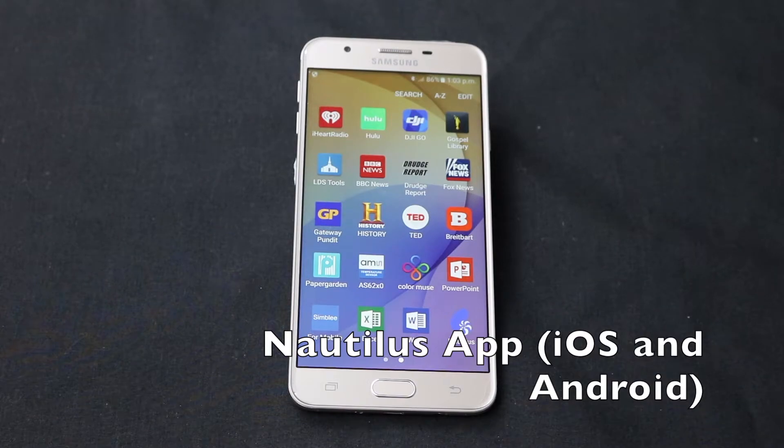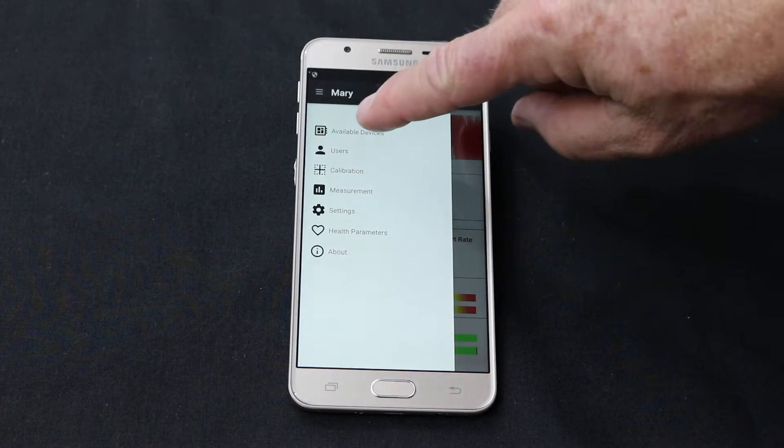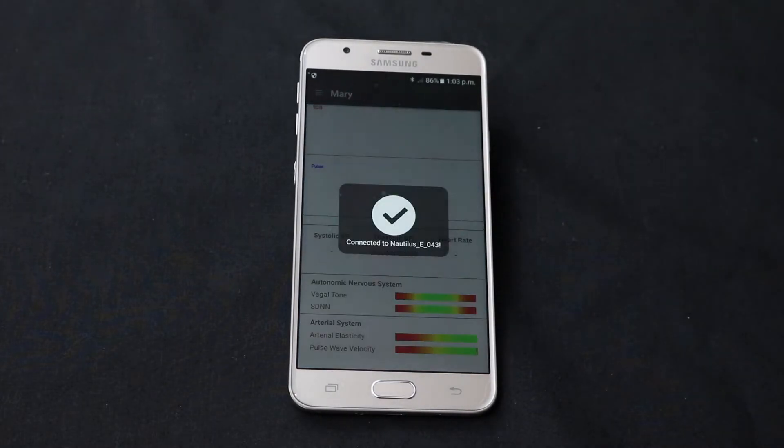The demonstrator uses the Nautilus application, which comes in both iOS and Android versions. Once the Nautilus app is launched, go to available devices and connect with the demonstrator.